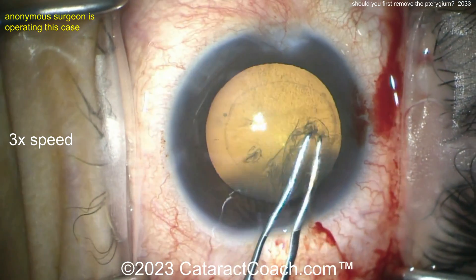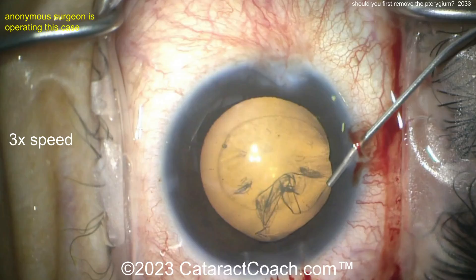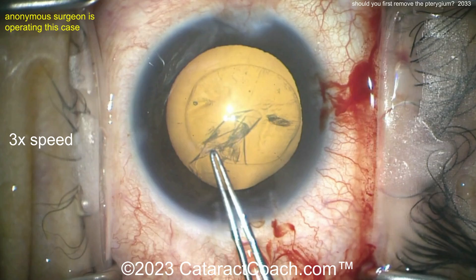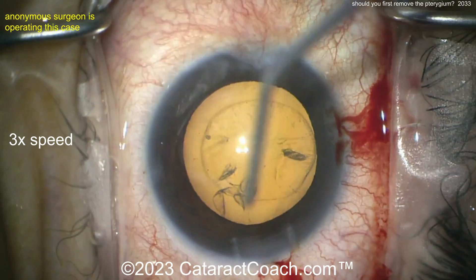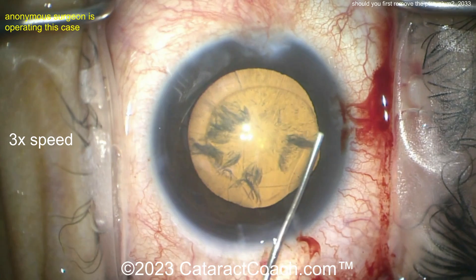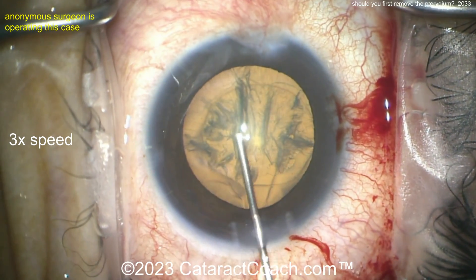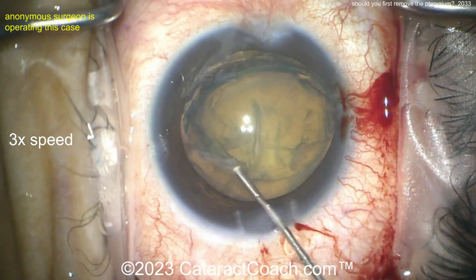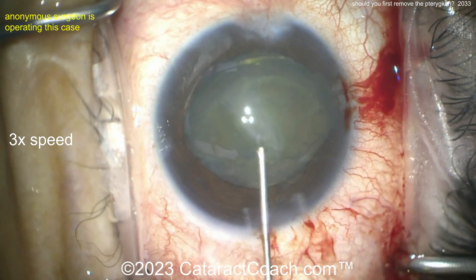If you do decide to remove the pterygium first, do an autograft, clean it up nicely, then give the patient at least three months to return to a normal K value. You can follow the patient post-op with serial topographies or serial keratometry to make sure the K value has returned and stabilized. The key is you want two readings about a month apart that are stable with no difference. There we go — here comes the nucleus being popped out of the capsular bag.